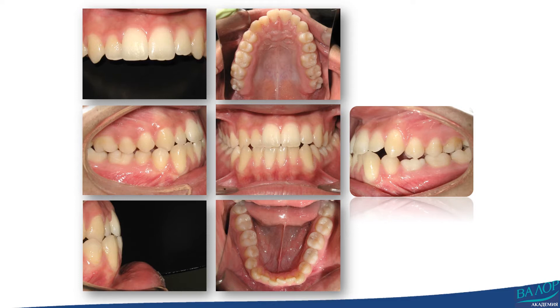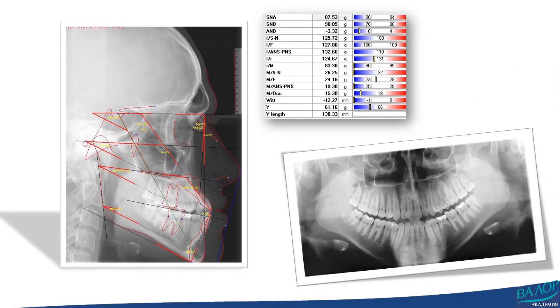The malocclusion is aggravated by edge-to-edge bite of the incisors and asymmetric mandible with shifting to the right. This traumatic occlusion of the incisors, left untreated, poses risks of gingival recessions later on in the patient's life. This accentuated Class 3 malocclusion shows in cephalometric tracing an A-B angle of negative 4 degrees and Wits appraisal of minus 12 millimeters, hypodivergent growth pattern, compensatory maxillary incisor proclination and mandibular incisor retroinclination. This is clearly a surgical case.